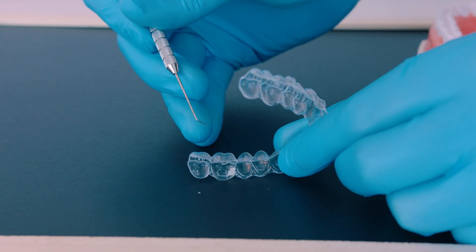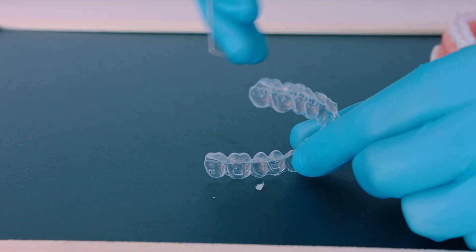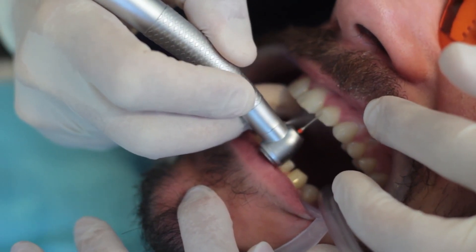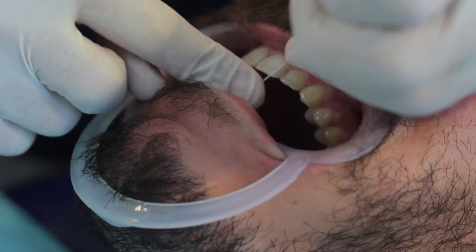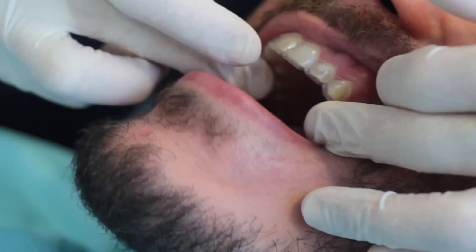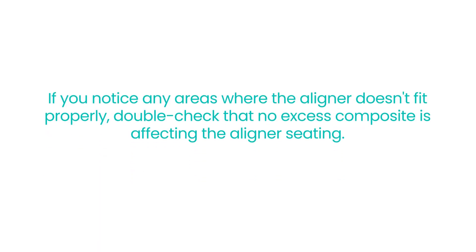Additionally, if one attachment debonds during treatment, you can reattach it using the current aligner step as a template after ensuring the fit is perfect. Use a carbide finishing burr to carefully remove any excess composite material, making sure not to apply too much pressure or change the original attachment's shape. After removing the excess composite material, use dental floss to check the contact areas for any remaining composite. Finally, insert aligner number one into the patient's mouth and ensure it's fully seated. If you notice any areas where the aligner doesn't fit properly, double check that no excess composite is affecting the aligner seating.